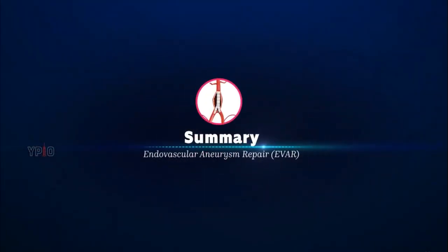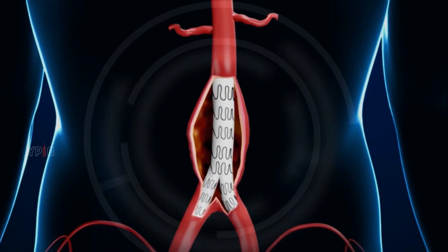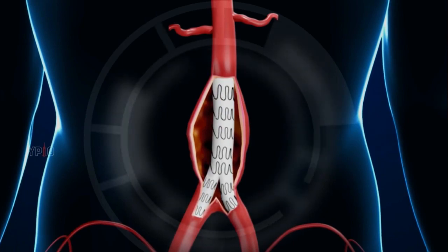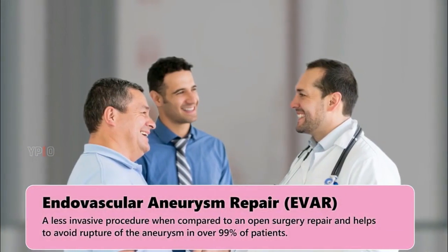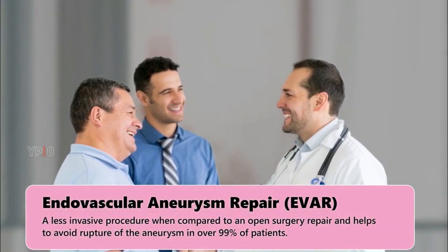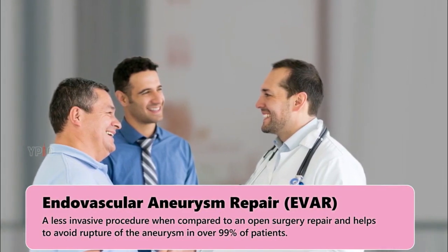Summary. Endovascular aneurysm repair is recommended as a preventative treatment to avert aneurysm rupture and death. It is a less invasive procedure when compared to an open surgery repair and helps to avoid rupture of the aneurysm in over 99% of patients.